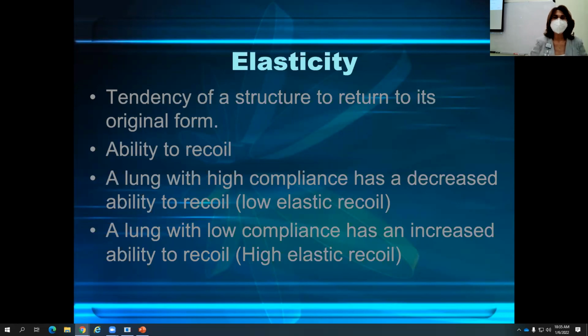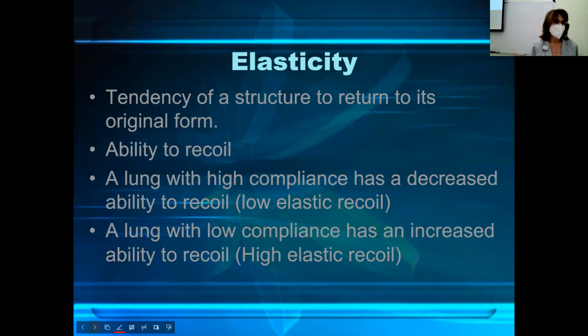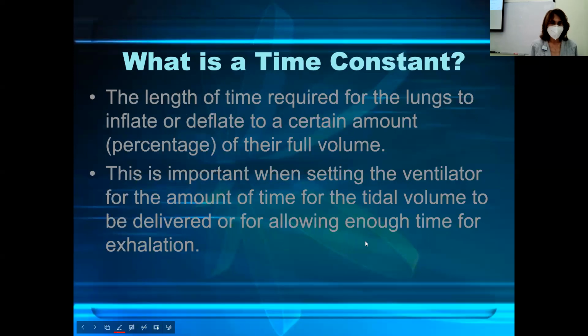Okay, patient with stiff lungs has low lung compliance but high elasticity. The lungs quickly return to their original shape during exhalation. Okay, and then all these terms, I think the best thing for you guys to do is to maybe make up some index cards and write all of these definitions on index cards and then just go through them until you get familiar with them.